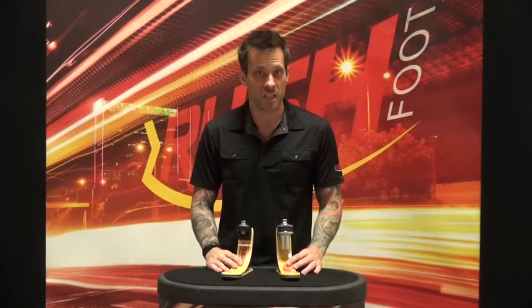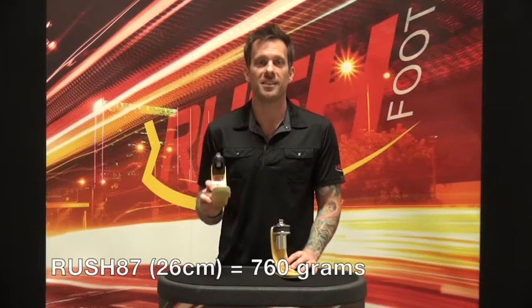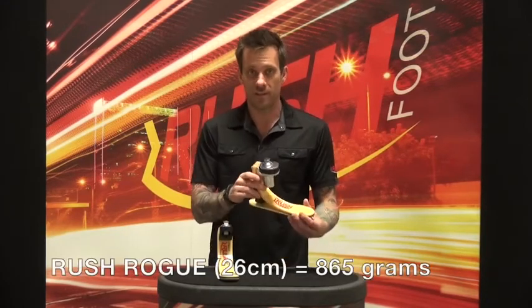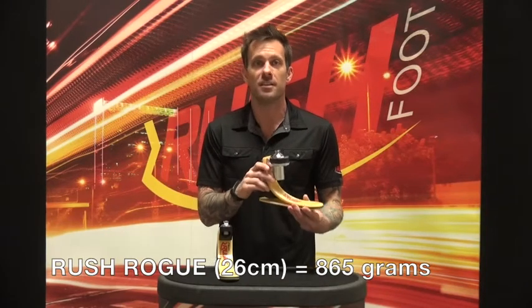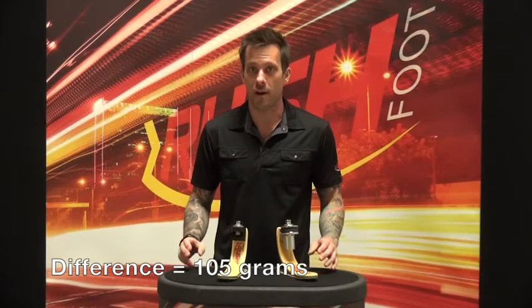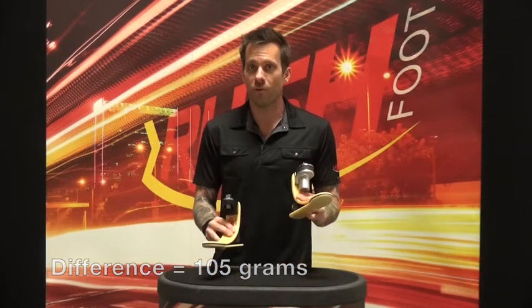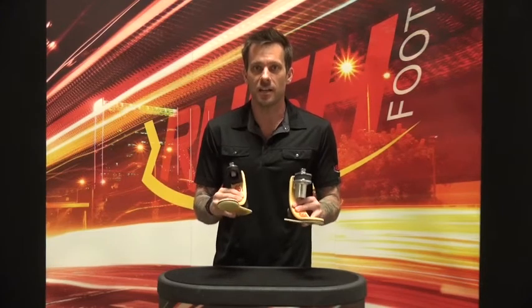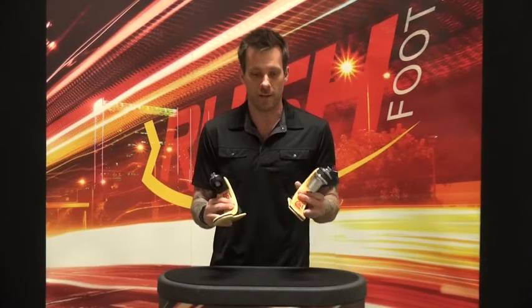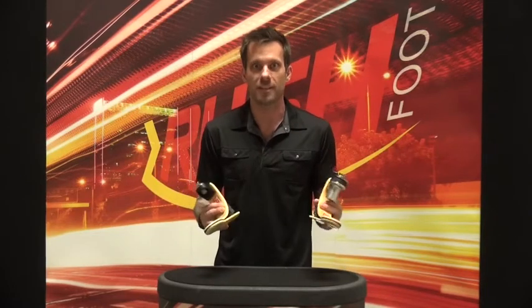So to be specific, I have here two size 26 centimeter feet. This one, the Rush87, weighs in at 760 grams, whereas the Rush Rogue, same size, weighs in at 865 grams. That's a difference of 105 grams. Now, holding the two feet here in my hands, you will see a slight increase on the Rush Rogue, but it's barely noticeable.